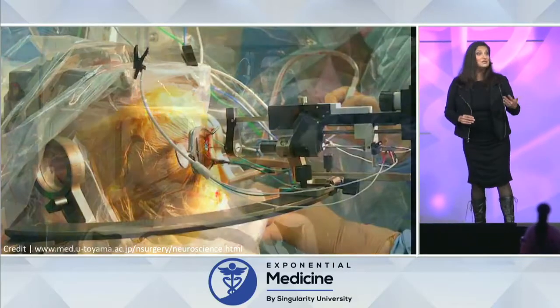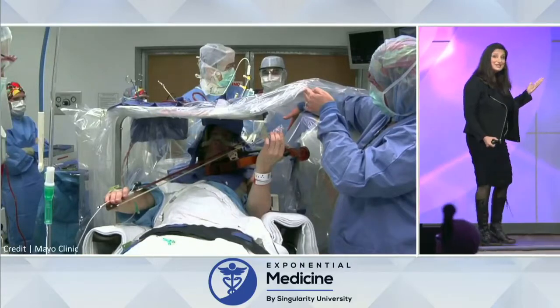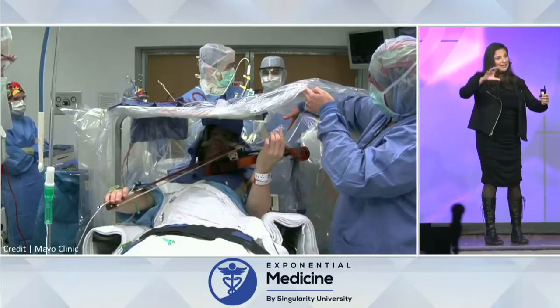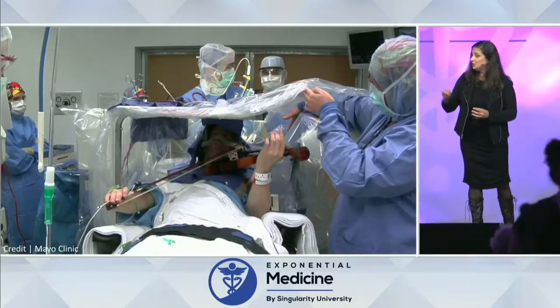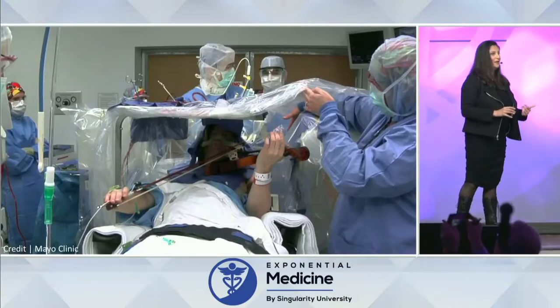And the surgeries are done awake, as you see from this clip from the Mayo Clinic, where you actually have a violinist who is playing in the operating room. And what they're able to do is actually track his tremor using a bow with a 3-axis accelerometer in it. And as the electrode goes in and as they're injecting current, they can actually watch the tremor go away and his violin playing improve. Now, the problem with deep brain stimulation is you're sticking an electrode into the brain and it's generating this spherical electric field. So you get the desired effect within the electric field, but you also get a lot of undesired side effects.